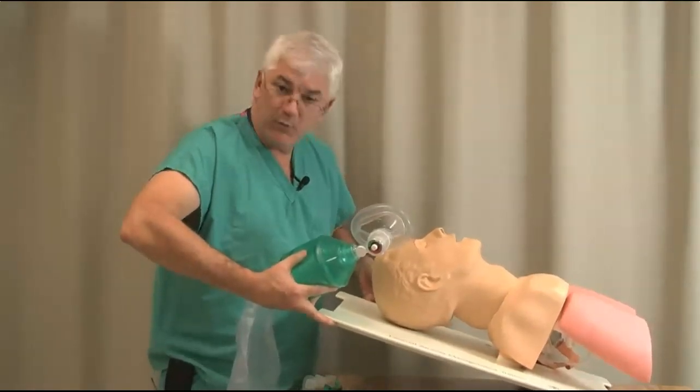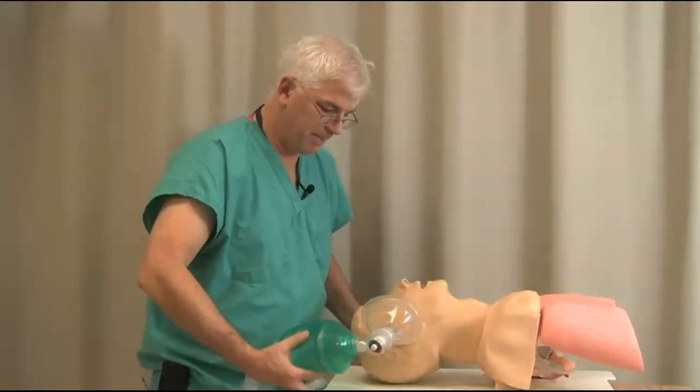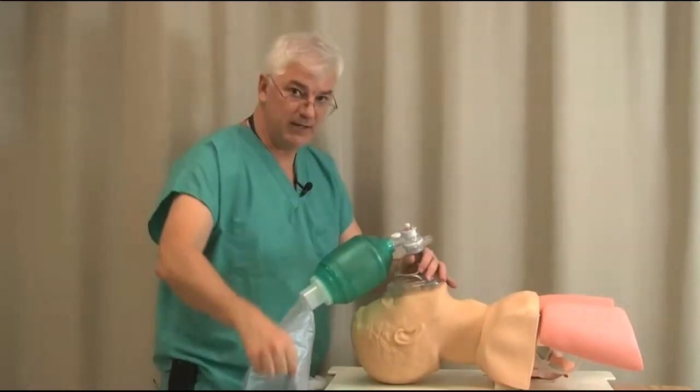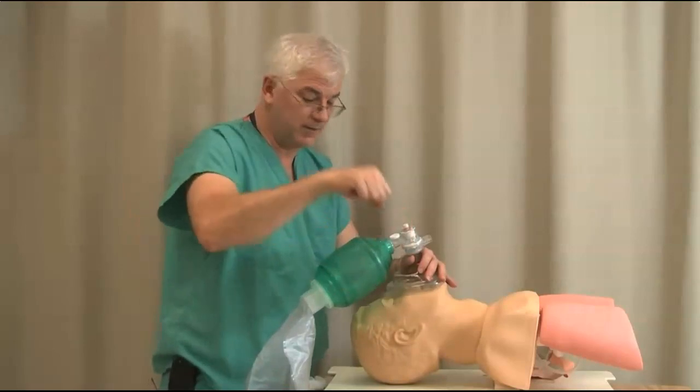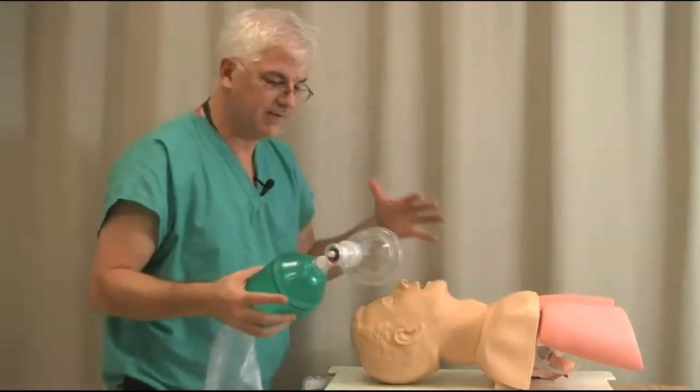So tilting them up really helps mask ventilate. It helps an awful lot. So think about that. When you're mask ventilating, you're always concerned that they might aspirate, so make sure you have suction nearby. Make sure you have suction right away. Now let's get into the actual mechanics of mask ventilation.